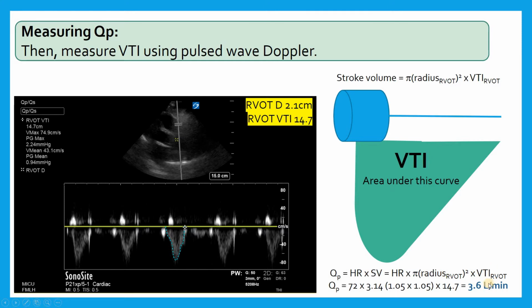And you might say, well, why would I measure that? Why don't I just measure my systemic cardiac output? Well, the time to do this would be if you had a significant shunt or an intracardiac lesion. That was actually relevant in this patient. This patient had some shunting. We could see that was the case. And we wanted to see if some of that was really an intrapulmonary shunt and how much pulmonary vascular flow there was relative to the cardiac output. In the end, they ended up being about the same, so I wasn't sure what to make of it.